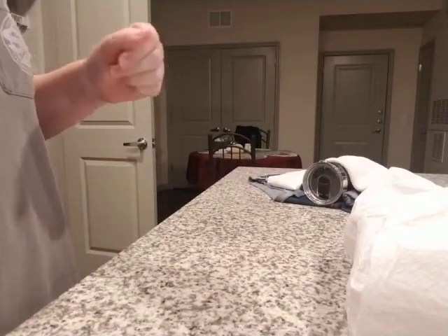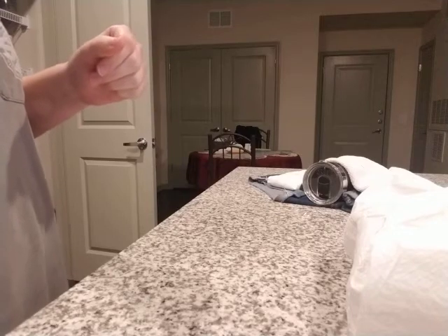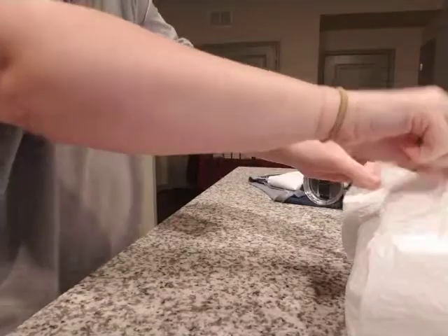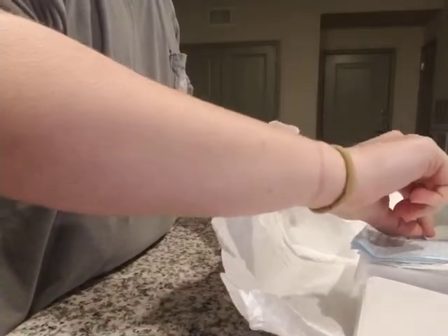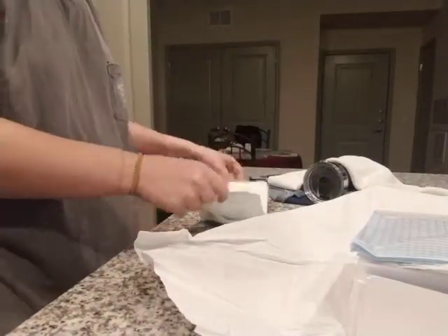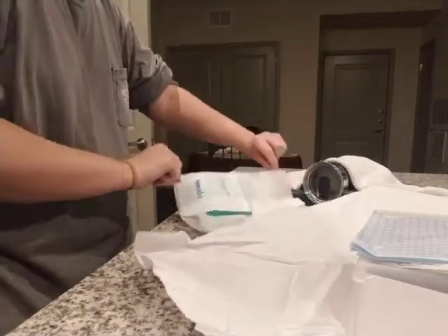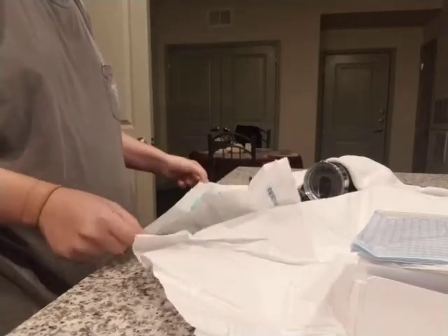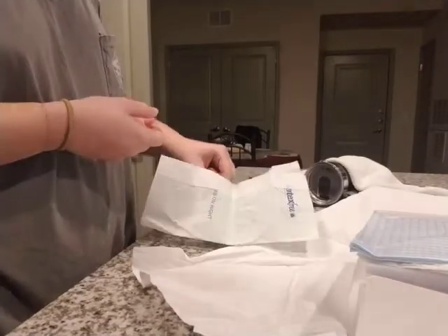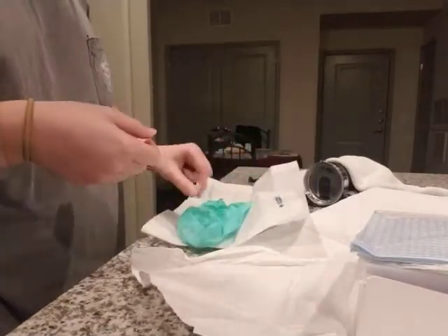Now I'm going to place the catheterization kit on a clean surface and open the wrapper using sterile technique. I'm going to grab my sterile gloves. Papers are not cooperating.